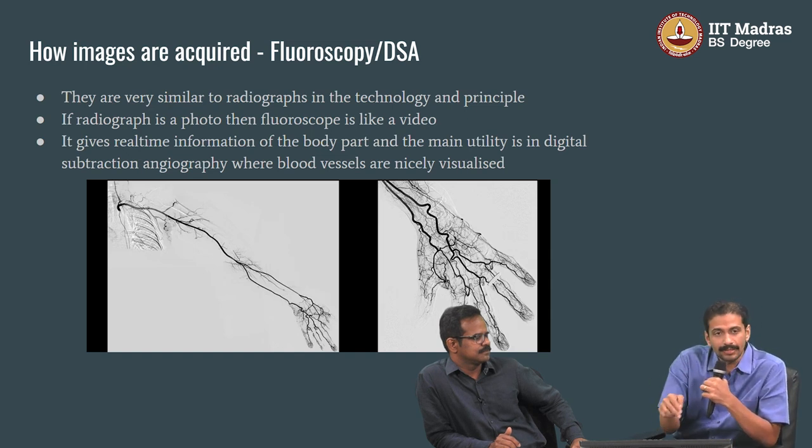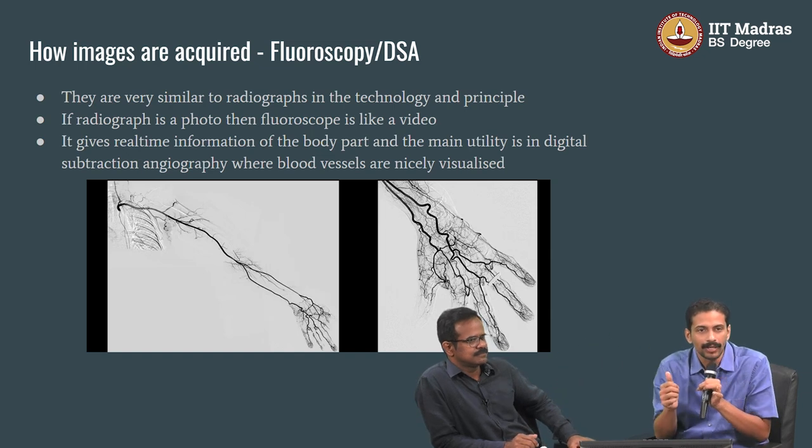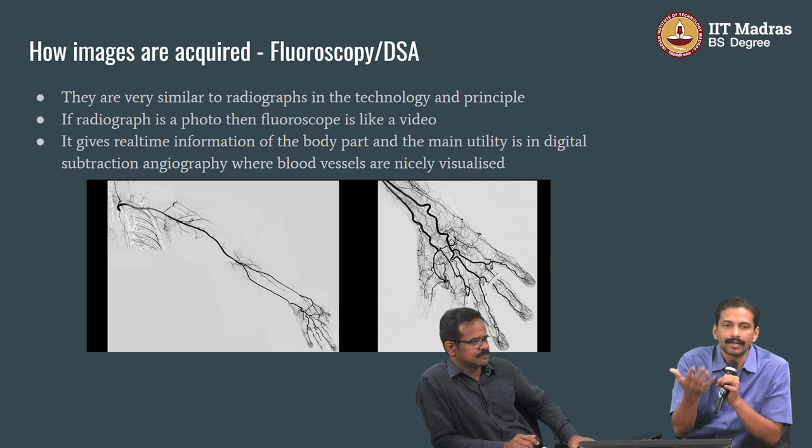To study this, when you are injecting something, obviously you are looking at something moving over a period of time, spreading into the body. So you cannot capture it just with something like a snapshot modality.